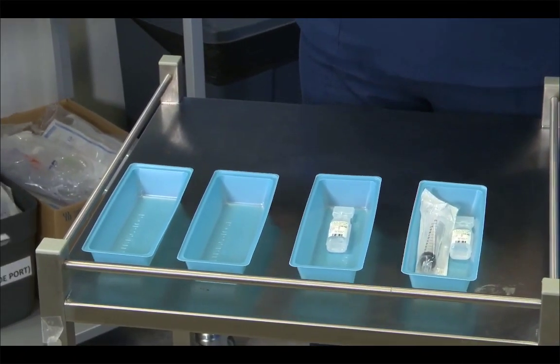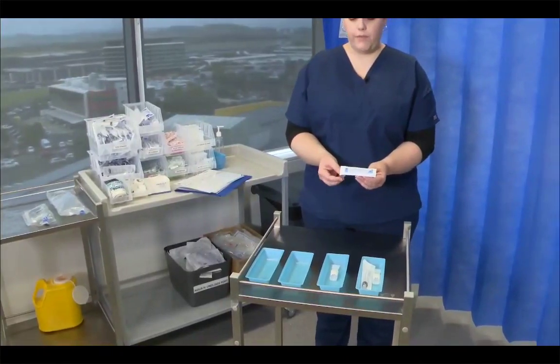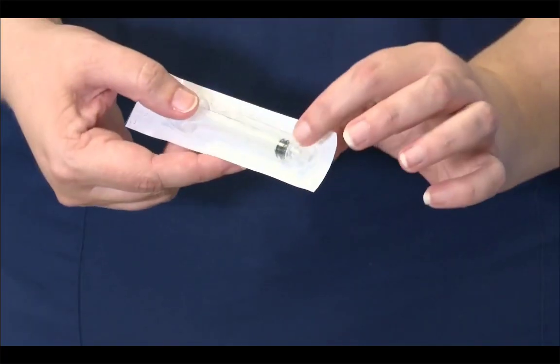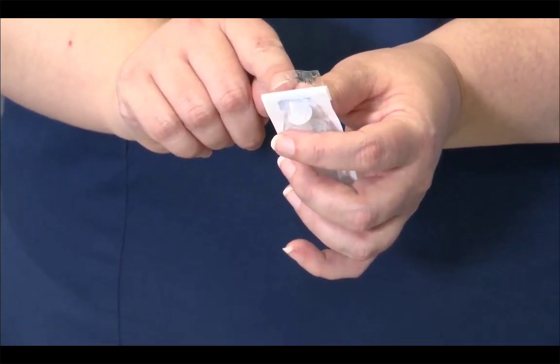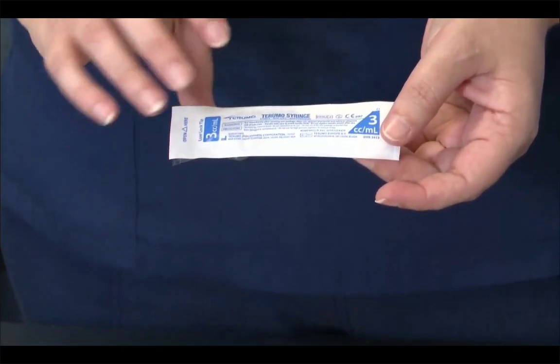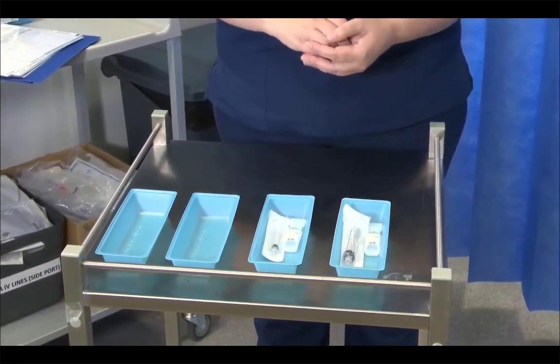So for this to keep us straight in my head, I like to grab a 3 mil syringe because I only need about 0.5 of a mil. So again, this is a 3 mil Luer-lock syringe, and again I'm checking the expiry on that, and that is 2027. 3 mil Luer-lock, and again that's going into my blue tray.